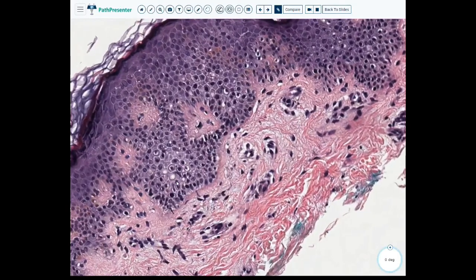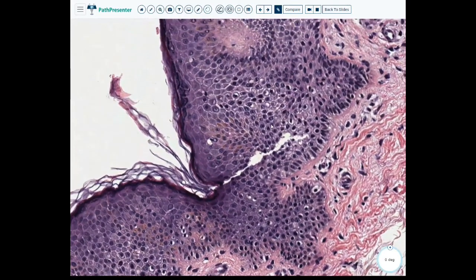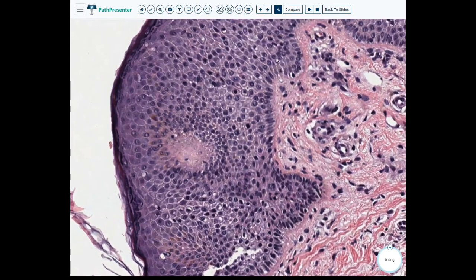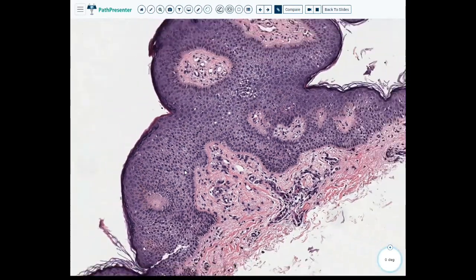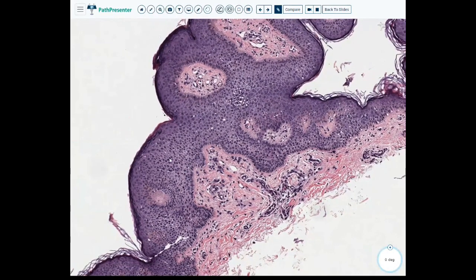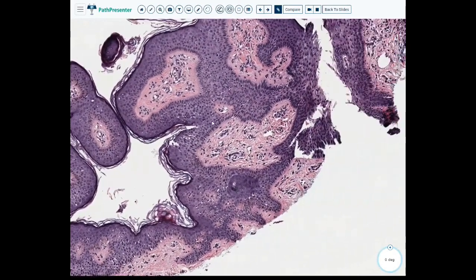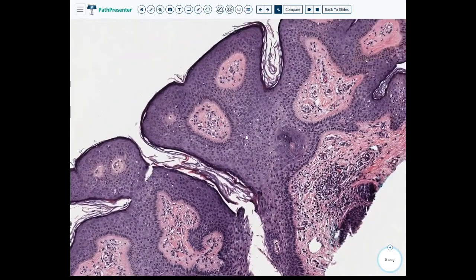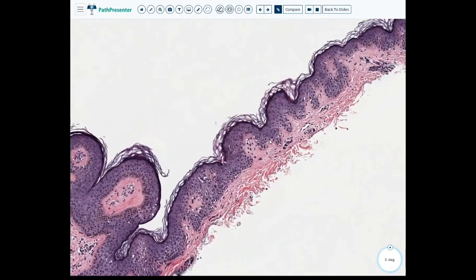We'll go here because this to me actually looks like a nest. So we have these basally situated nests of melanocytes. Again, a little more over here and here. But I think these are maybe somewhat difficult to pick up, and obviously the higher in power you go, the more you lose that sense of nodularity. And everything is confined to the epidermis. And even though this looks like maybe it's a little papillary, I'm not seeing anything that really strikes me as atypia.